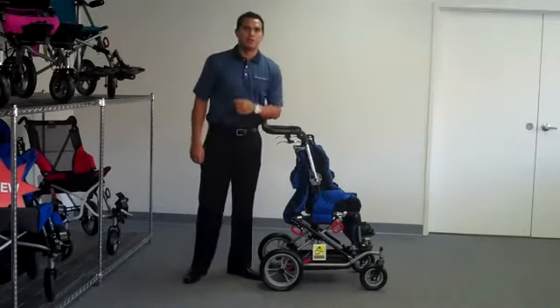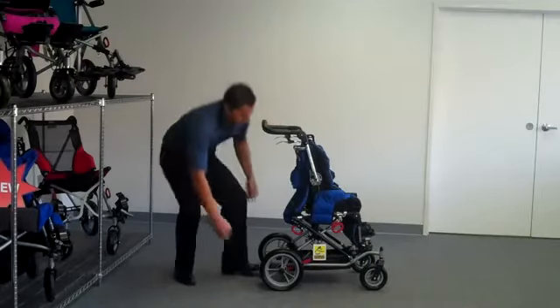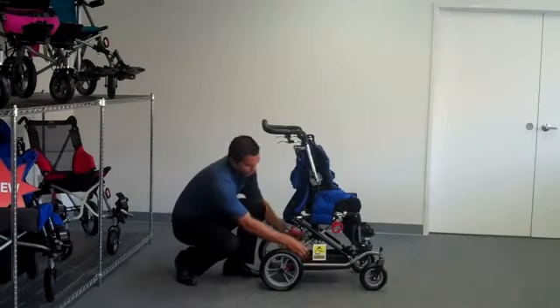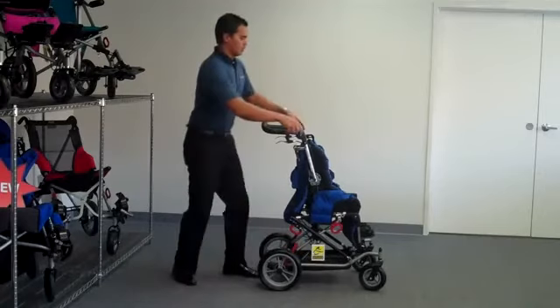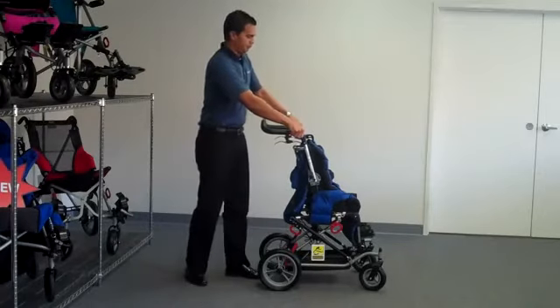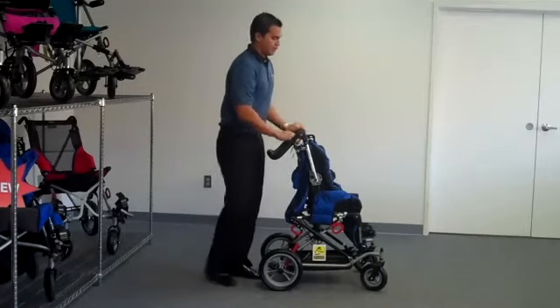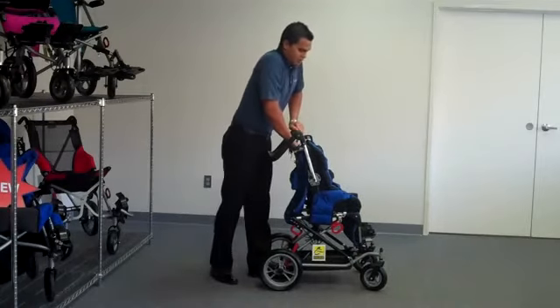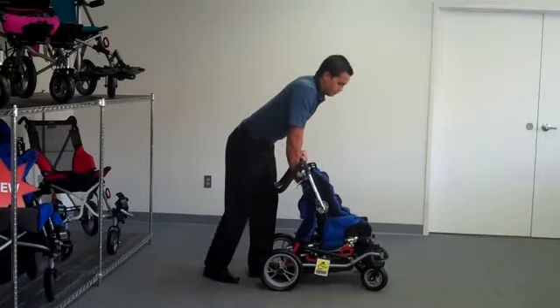Today we're going to demonstrate how to operate the high-low feature of the CuddleBug. To operate the feature, simply engage your brakes, lower your push handle by simply pressing on your gray push buttons, and with your weight centered above the chair, pull on your high-low lever and lean forward.